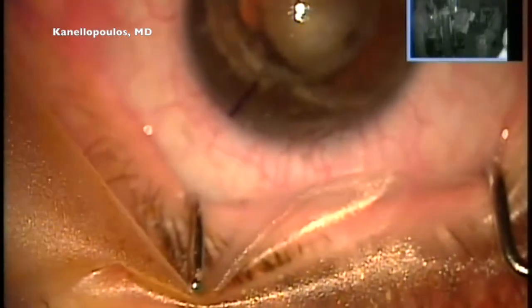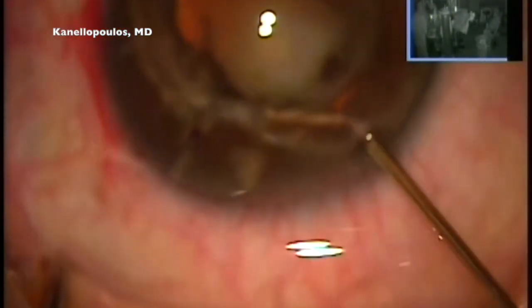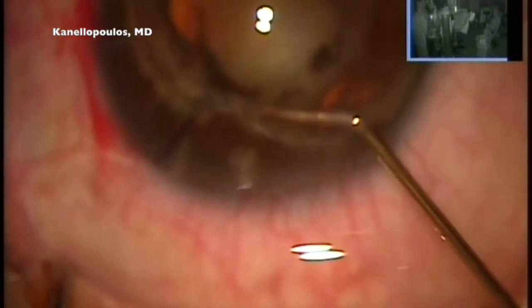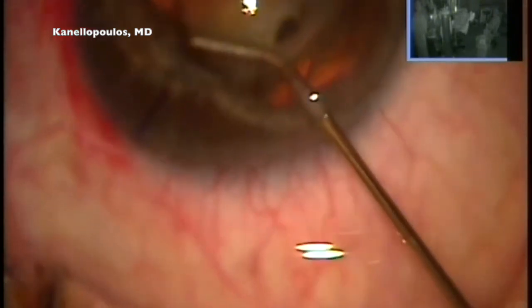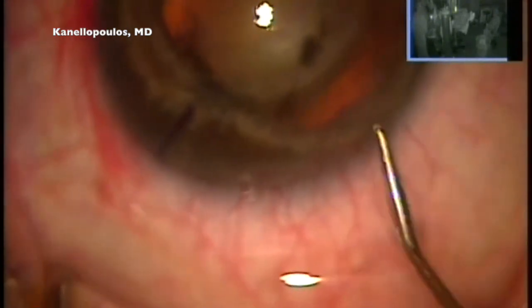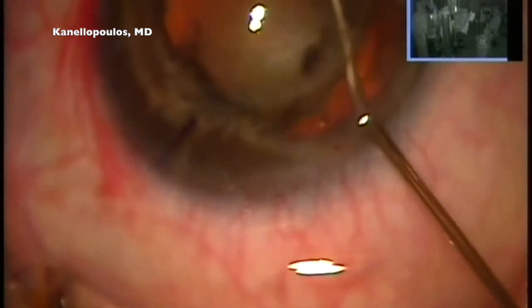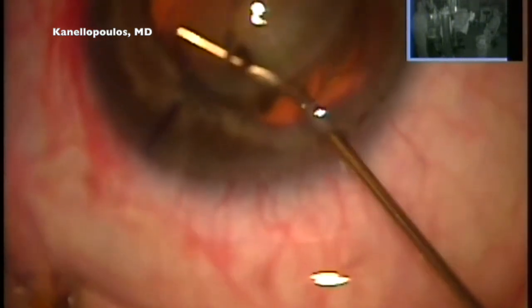This brings us to 40-something degrees, marked here with the Asico toric IOL marker. Going in with my 2.75 keratome, using some epinephrine to attain more dilation — but there is a membrane connecting the central pupil, and this is a little bit of a problem in the approach. Obviously, we want to treat this very significant iris damage as well.